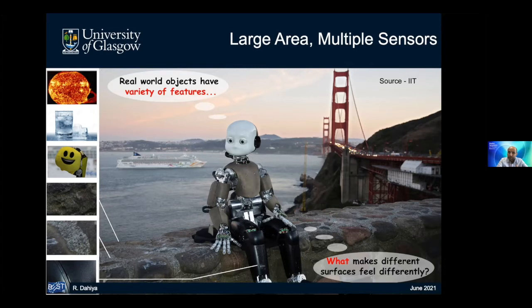Distribution of electronic skin or tactile sensing all over the body has been considered one of the challenges when we talk about implementation. That challenge comes because a large number of sensors are to be placed with different sensitivities on different body parts. In some places there is high resolution, other places low resolution, etc. Then you have to look at the distributed electronics. Currently, electronics is largely planar, and limited to chip size. So distribution over a large area still remains a challenge because you have to have a uniform response of electronics or transistors.